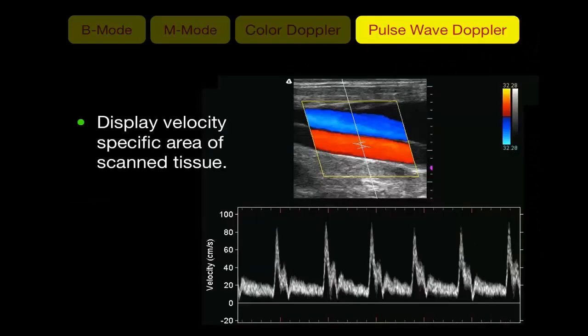Pulsed wave Doppler displays the velocity at a target point on the screen. You start with the B-mode image, place a target point, and activating pulsed wave Doppler gives an image where the vertical axis displays velocity and the horizontal axis displays time, allowing you to measure velocity at the target point.